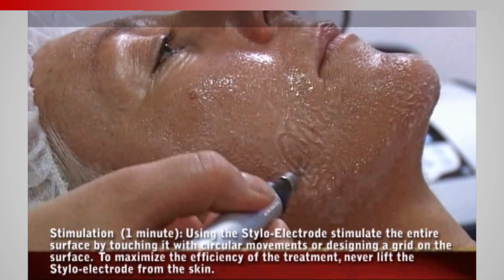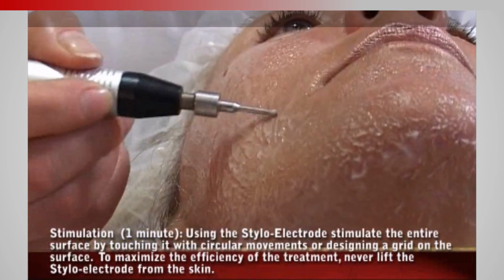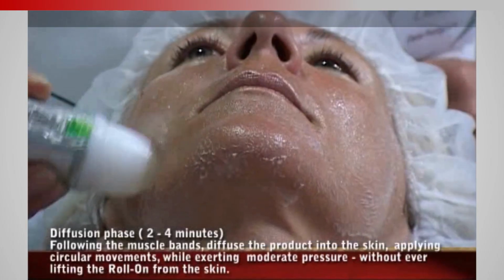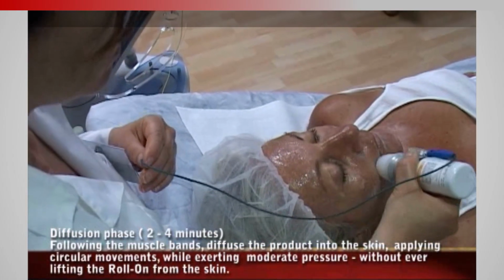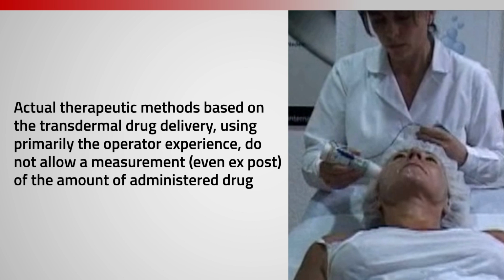In this video, you can see an aesthetic electroporation treatment. Transdermal delivery effectiveness is evaluated by numerous studies in the laboratory. However, performance outside of the laboratory in the context of daily clinical application is less investigated. The absence of effective and standardized in vivo measurement methods for locally acting drugs makes it problematic to ensure that the drug has met its target.